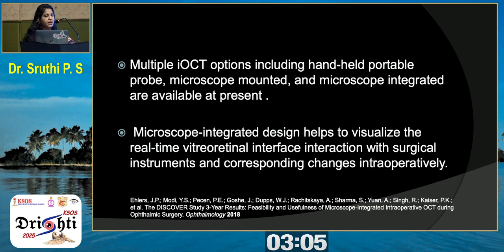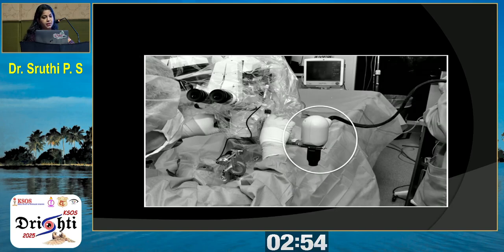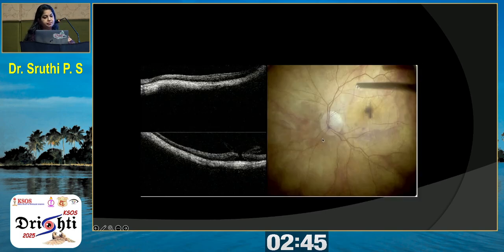This microscope-integrated design helps to visualize the real-time vitreoretinal interface interaction with the surgeon's instruments, and corresponding changes can be assessed intraoperatively. So this is an example of a microscope-mounted one, where in the circle you can see the IOCT mounted with the microscope.